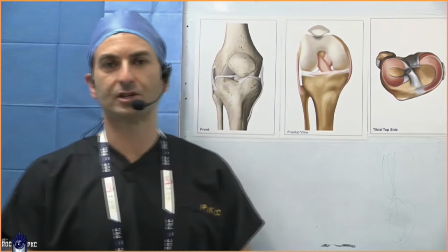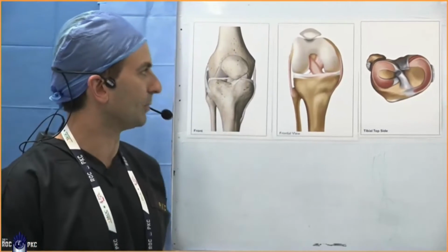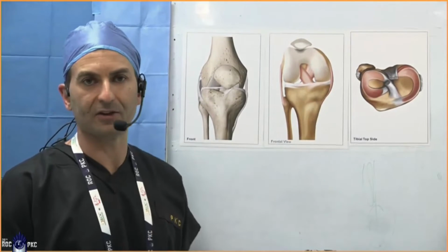Today's fixation, we're going to use adjustable buttons, so ultra buttons on both sides of the joint. And so my plan today will be, we'll scope the knee, we'll assess the notch, we'll clear out the notch.